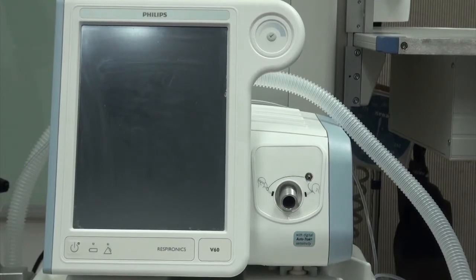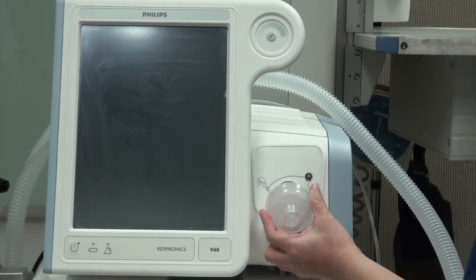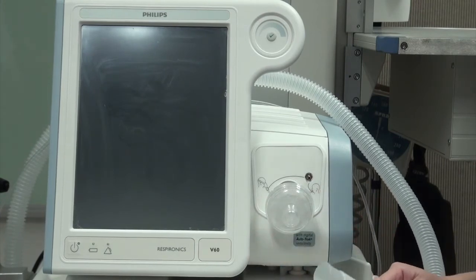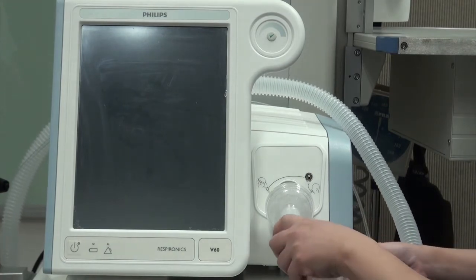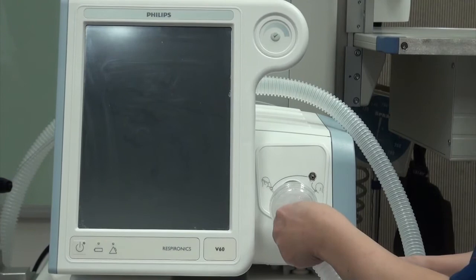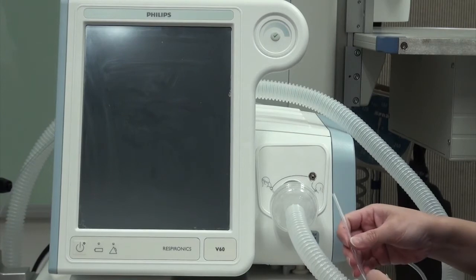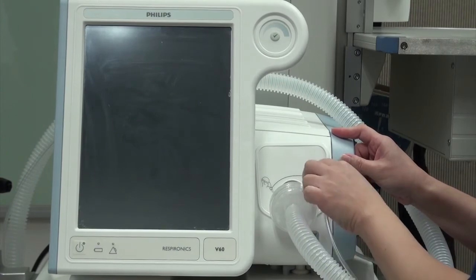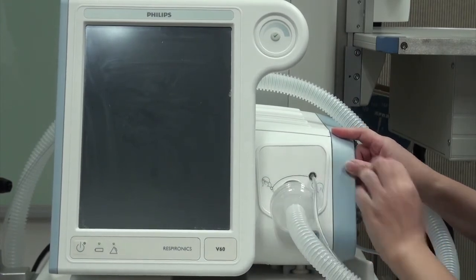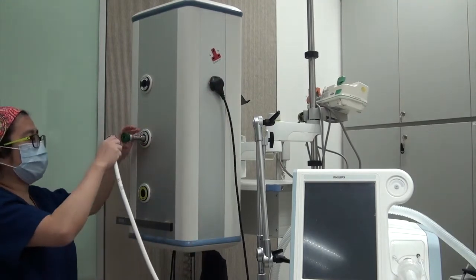This is how you set up the V60 machine. First, you attach the bacterial viral filter to this outlet here. And then you attach the machine end of the NIV circuit to the bacterial filter. Ensure that it screws on tight. You can connect the proximal pressure line to the small port here. Plug in the power and the oxygen adapter.